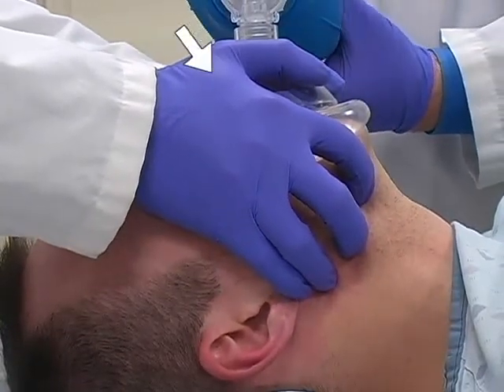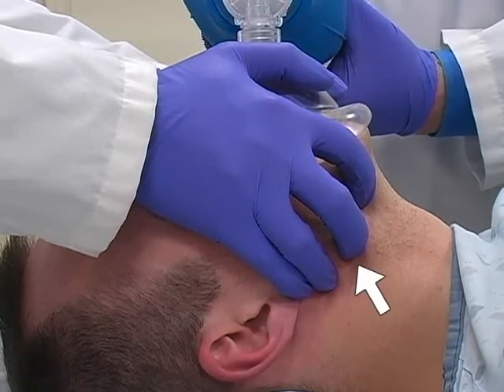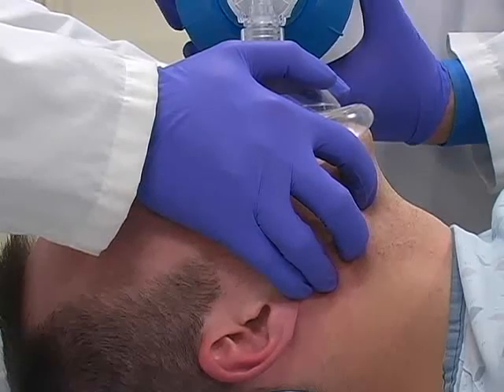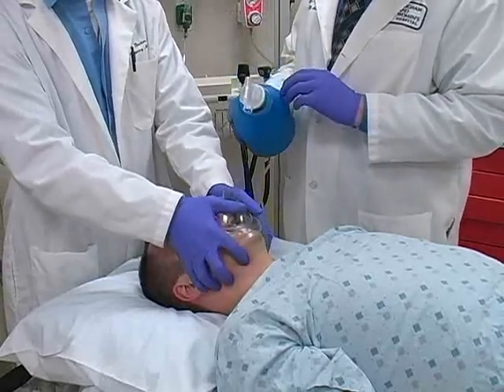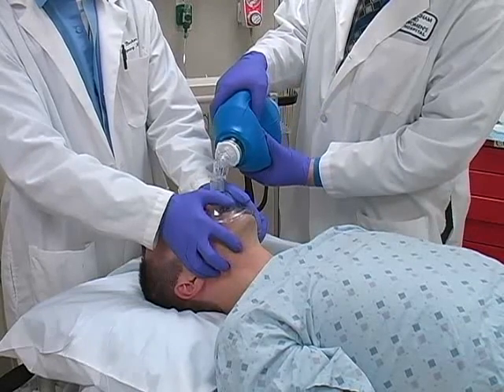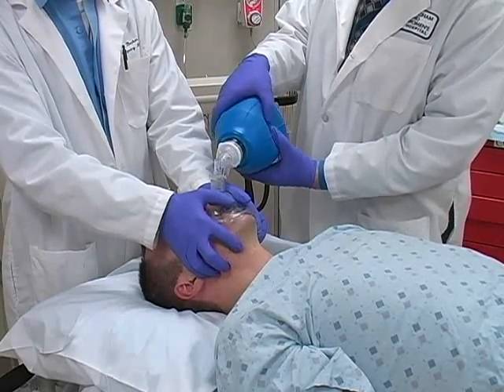Pressure is applied to the mask with the thenar eminences, while the fingers pull the mandible upwards. Chin lift and jaw thrust may be applied concurrently. This technique is easier to perform, allows stronger hand muscles to maintain a proper seal, minimizes fatigue, and enables 4 fingers to perform chin lift and jaw thrust.